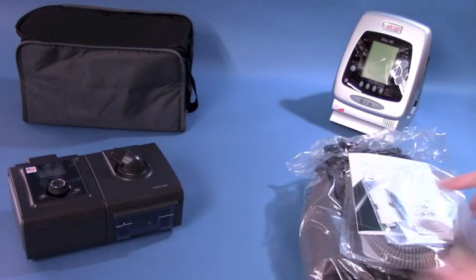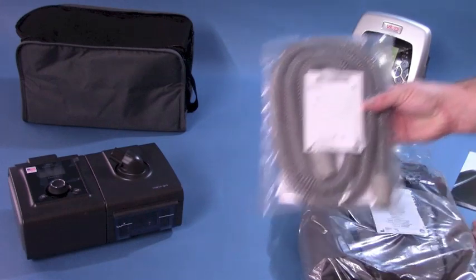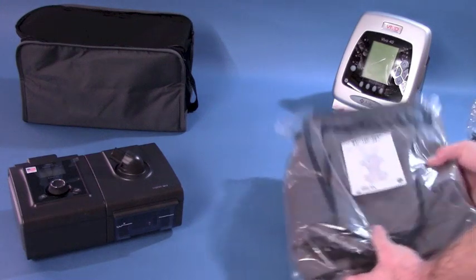Included with the Vivo40 is a user manual, tubing, disposable filters, a power cord, and a travel bag.